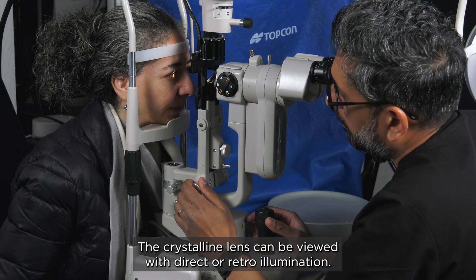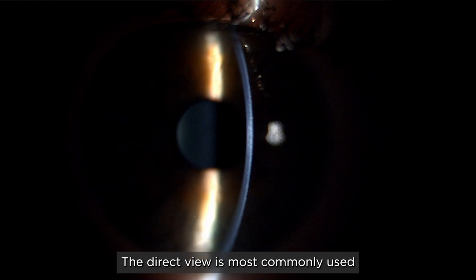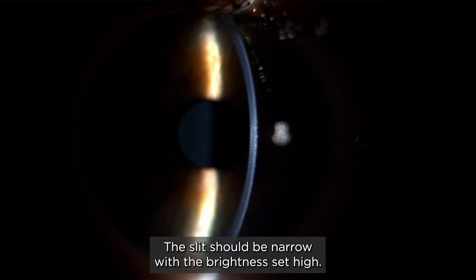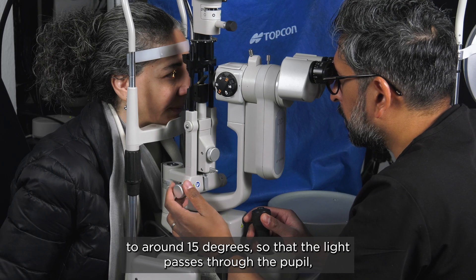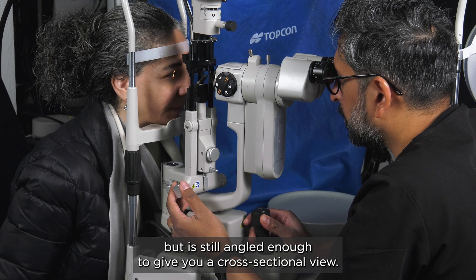The crystalline lens can be viewed with direct or retro illumination. The direct view is most commonly used and starts with an optic section focused on the central cornea. The slit should be narrow with the brightness set high. Start with a low magnification such as 10 times. Reduce the angle of the illumination system to around 15 degrees so that the light passes through the pupil but is still angled enough to give you a cross-sectional view.